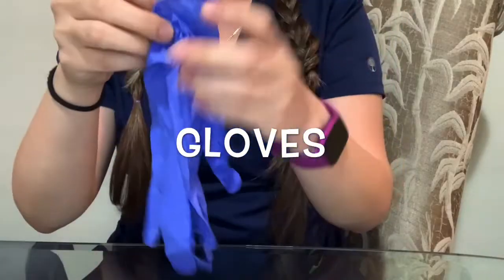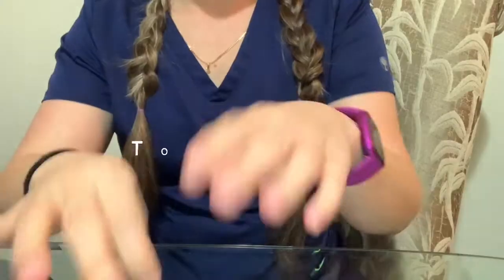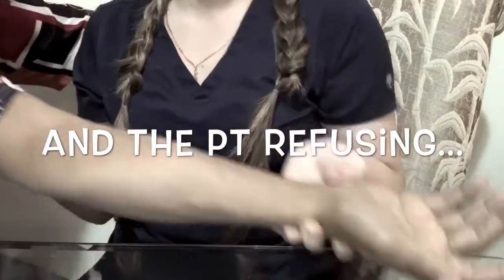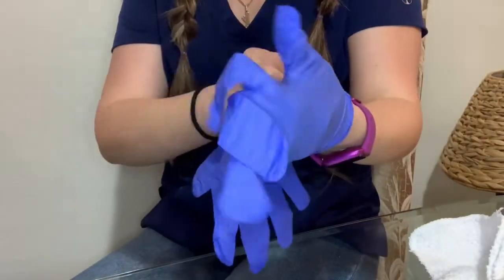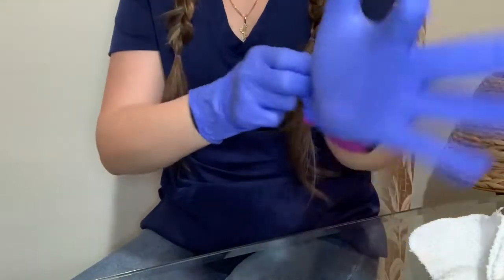Let's get into the video. I'm gonna show you what supplies we are gonna use. I forgot to mention the dressing in the supplies earlier. Now I have gloves on — I previously washed my hands — and we're gonna get our supplies ready.